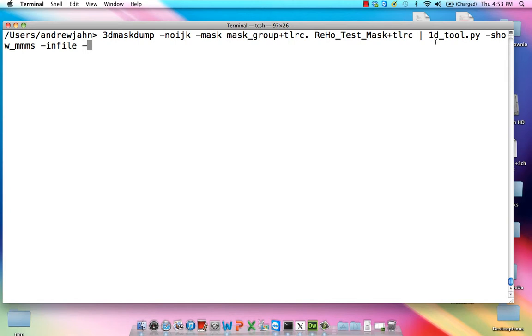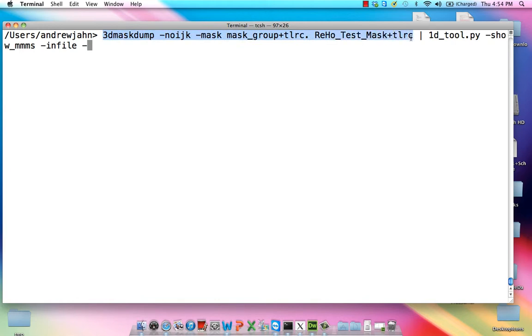We'll pipe it using this bar right here. We're going to pipe that output into 1DTool.py. This option, show MMMS, is going to calculate things like mean and standard deviation. For the infile, this dash right here just means for the input, simply use the output of this previous command right here.